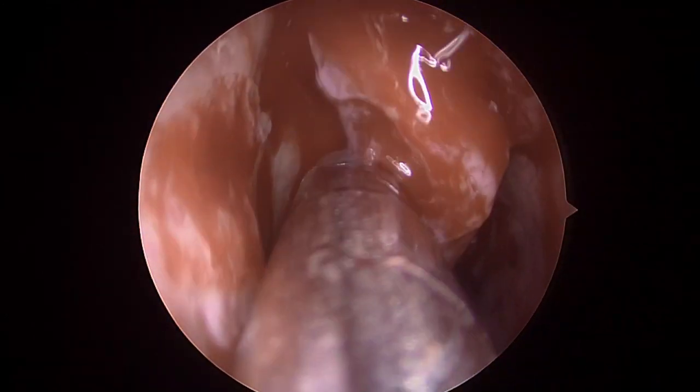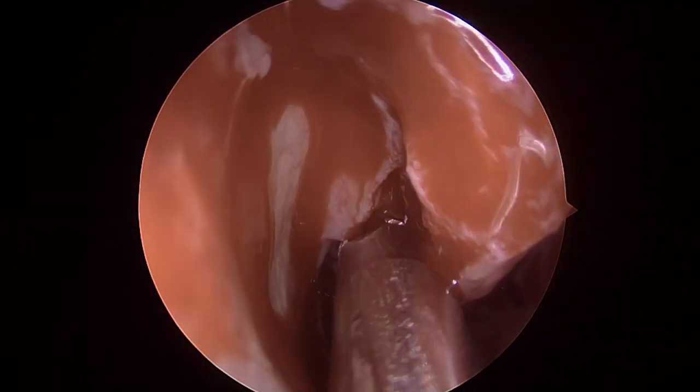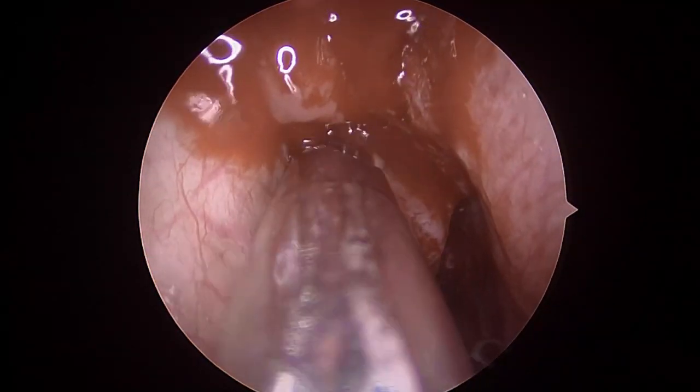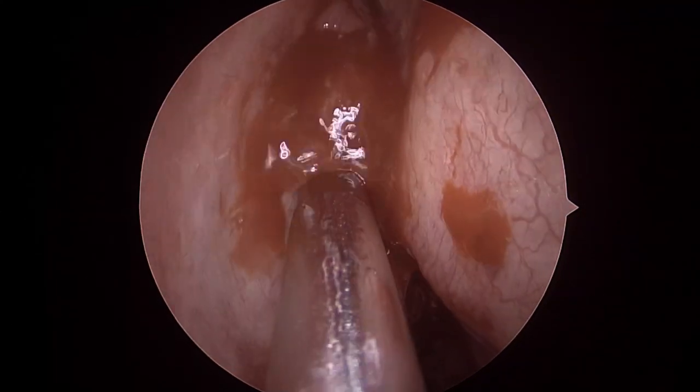And now we are starting to define the middle turbinate. We can see the glimpse of the polypoidal bulla as well as the uncinate process coming into view. And so now everything in front of it can go.